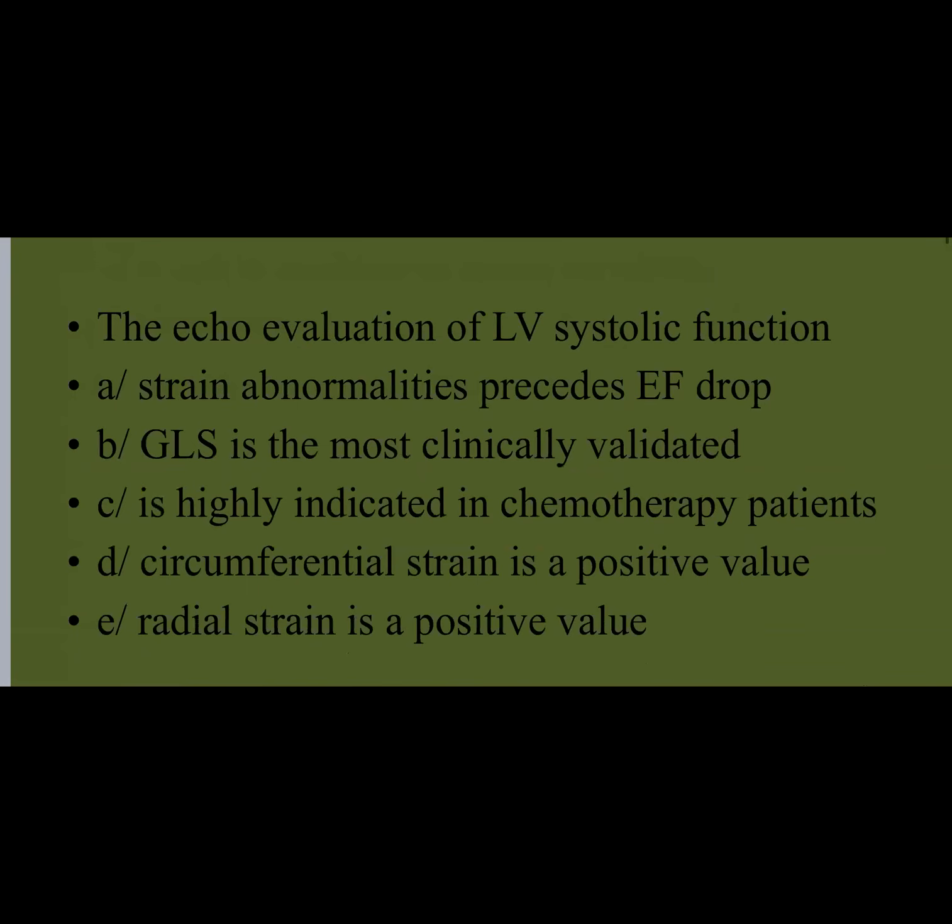The echo evaluation of LV systolic function. Strain abnormalities precede ejection fraction drop. Global longitudinal strain, GLS, is the most clinically validated. It is highly indicated in chemotherapy patients. Circumferential strain is a positive value. Radial strain is a positive value.